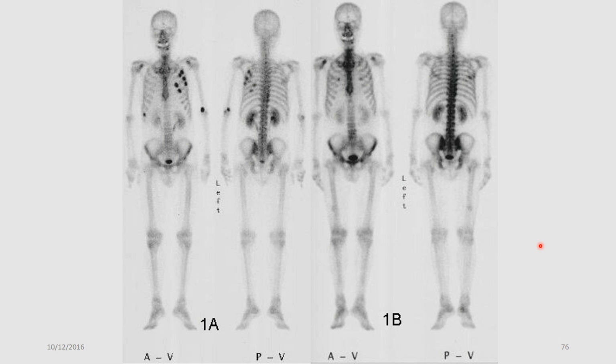Something a little bit more easily recognizable is a nuclear medicine bone scan, quite commonly done looking at cancer and seeing if cancer has spread, how far it's spread, or if it's localized to a certain area. They will see if it's spread or not. And these are just anterior and different views. They just represent different views, basically. And the dots, the darker spots, are areas of higher radiation uptake.